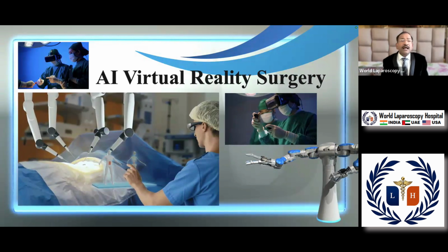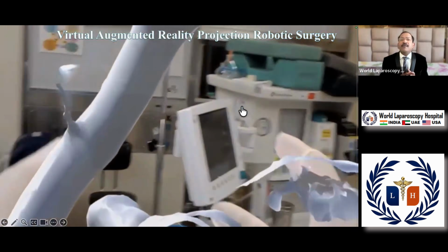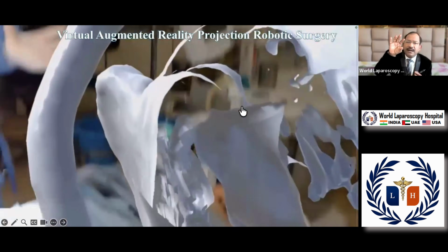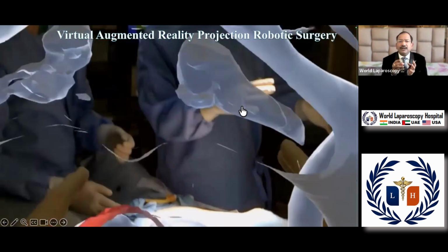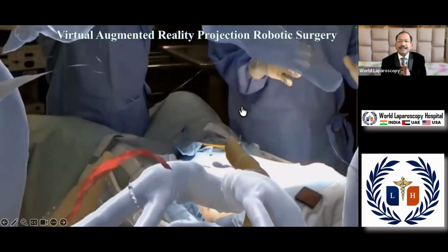But now you will use virtual glasses, and you can perform the procedure in the virtual environment, and you don't have to hold any master controller. With the finger directly, if you try in this virtual field to catch the fallopian tube, the movement of your hand, the robot will translate inside the abdomen of the patient.